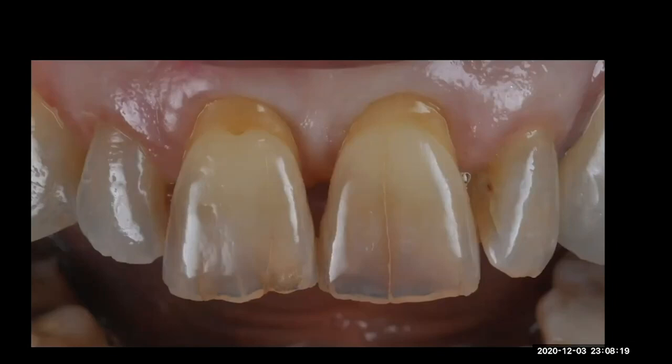When I looked inside the mouth and saw the palatal side of the centrals, I saw that the patient grinds completely the dentin that the teeth have in lingual, and leaves only the buccal part of the tooth. That's why we can see all the translucency through the buccal. What happened? The oral concavity is dark, so translucency plus dark, you can create some kind of translucency. That's why I was in shock with that picture, and I went back to the lab and said, listen, I think I can make something. I can develop something following that kind of teeth that I just saw.